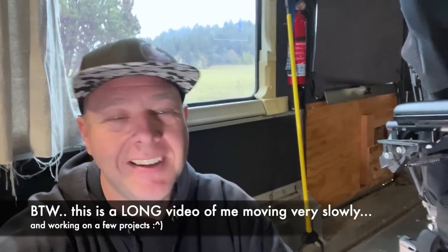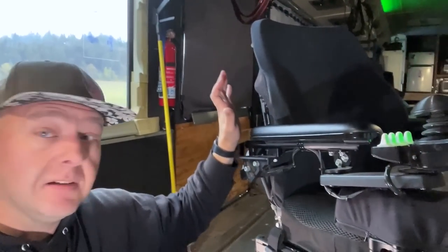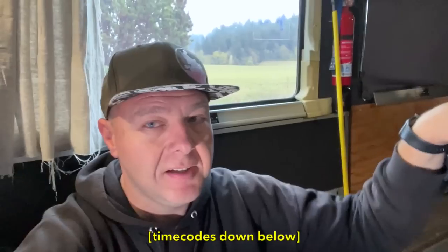Welcome back to the floor. Today we're going to be working on the F3. When I got this thing, the hardware used to attach my seat back to the direct backrest adapter — they didn't use the correct hardware when the DME put the chair together. I mentioned this in a previous video. It's not the most egregious thing in the world, but it's been squeaking and making weird noises.